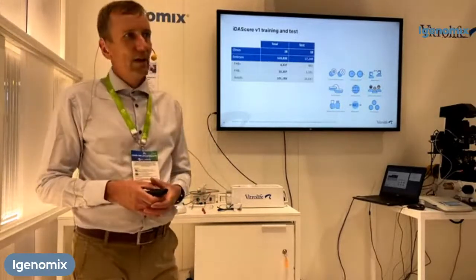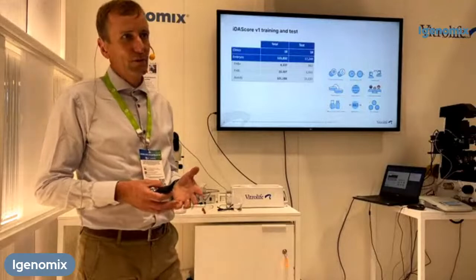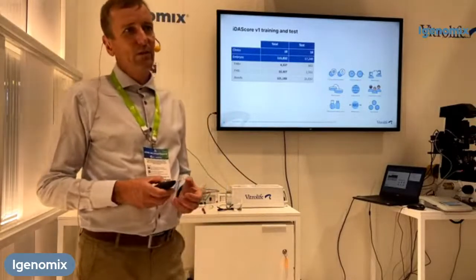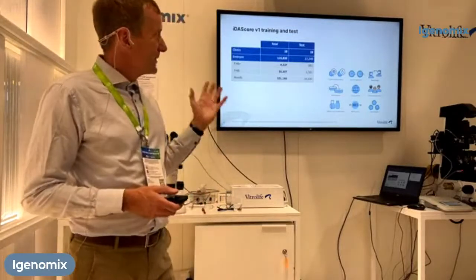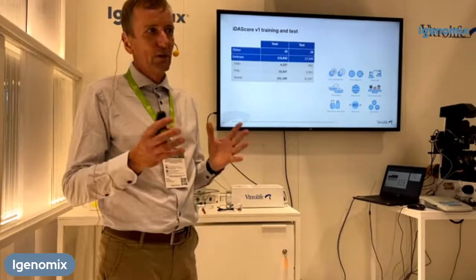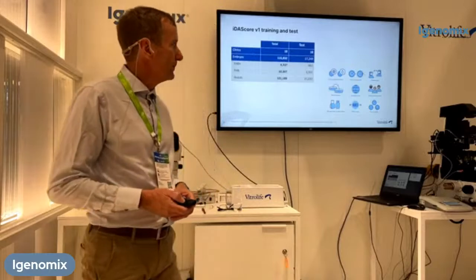Out of these embryos, 15,000 were transferred embryos, where we know the outcome, that is, if it was a positive fetal heartbeat or a negative fetal heartbeat. And as I said, we cover a lot of different clinical practices because we cover nearly worldwide data.